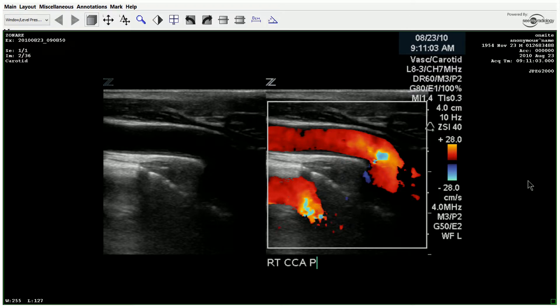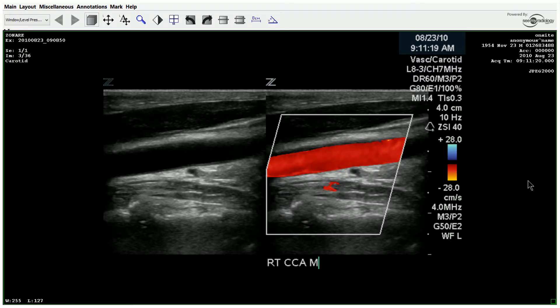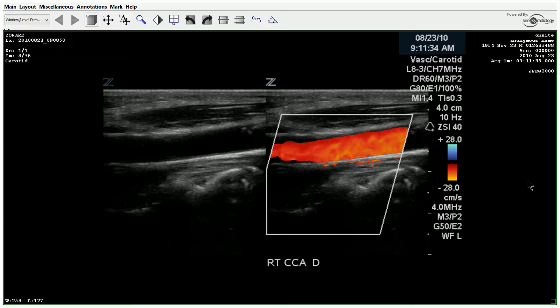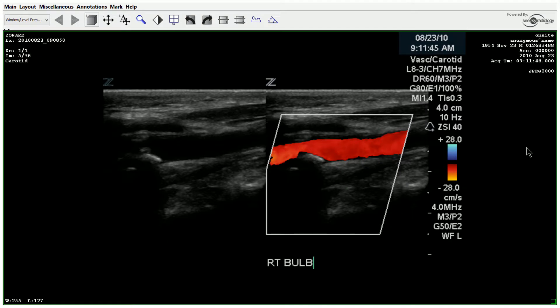Moving on to the common carotid. At the distal CCA, you see a little bit of plaque along the anterior wall, but that doesn't appear to be anything significant. You can tell by the color here it is pretty laminar, so there's no post-stenotic turbulence happening. There's another focal area of calcification — you can see the shadowing here at the bulb on the posterior wall.